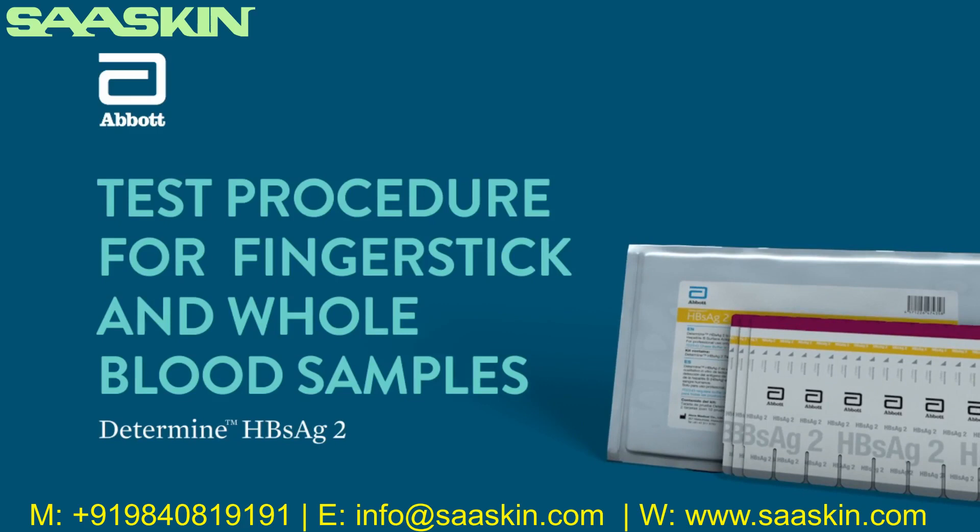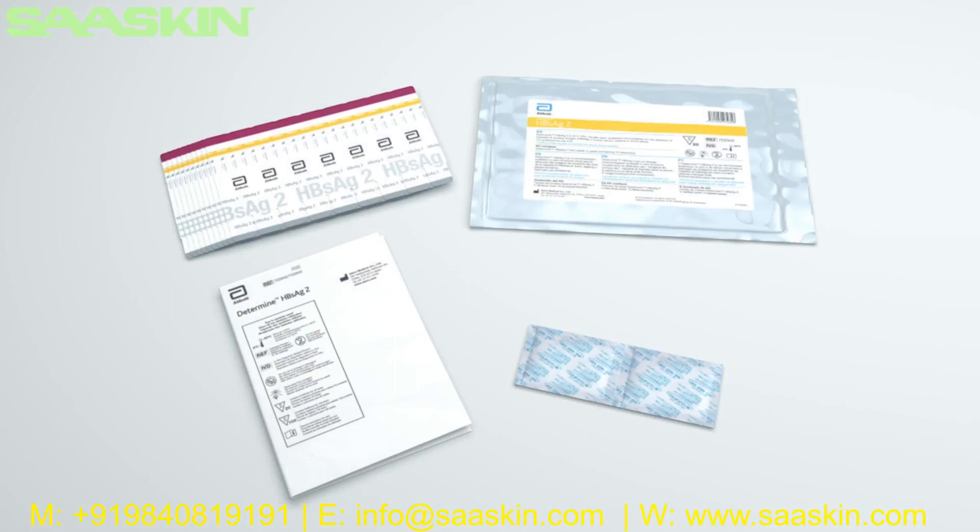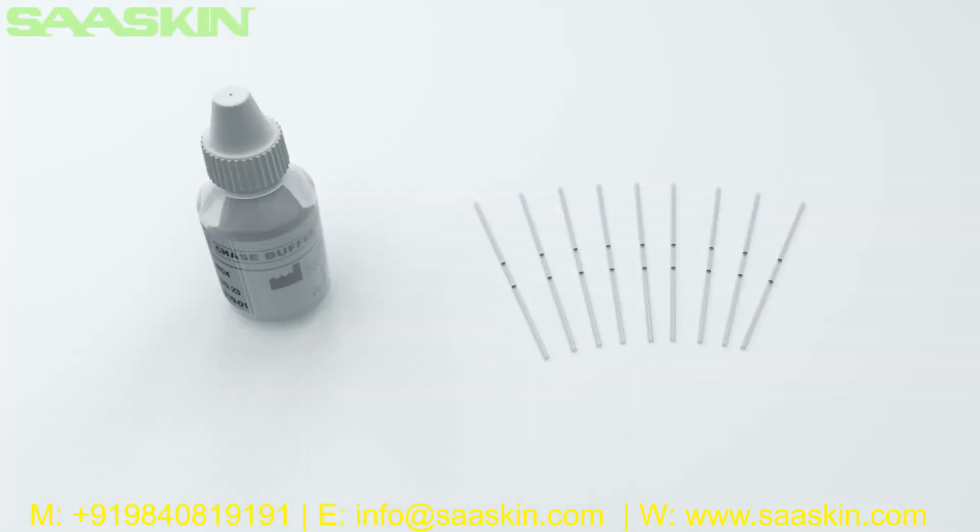The Determine HBsAg2 test procedure for finger stick whole blood samples. The Determine HBsAg2 test is a visually read qualitative immunoassay for the detection of hepatitis B surface antigen (HBsAg) in human serum, plasma, or whole blood. Each hepatitis B surface antigen kit contains one aluminum Ziploc pouch containing either 20 or 100 tests, a desiccant package, and package insert. Chase buffer and disposable capillary tubes for collection and transfer of finger stick samples are provided but separate to the kit.